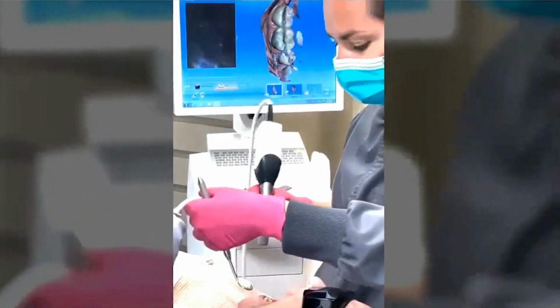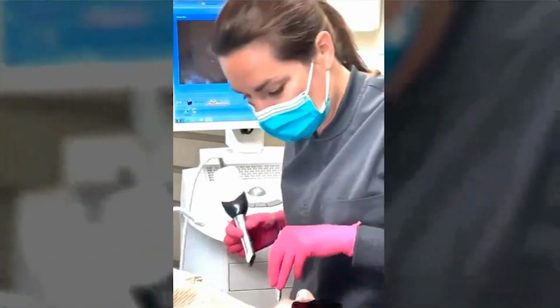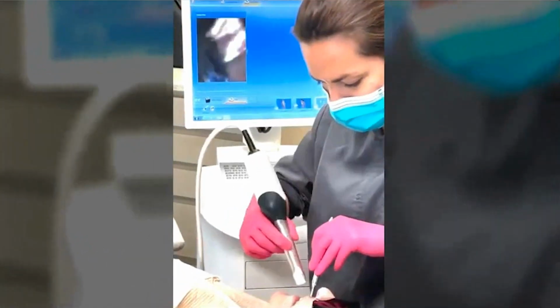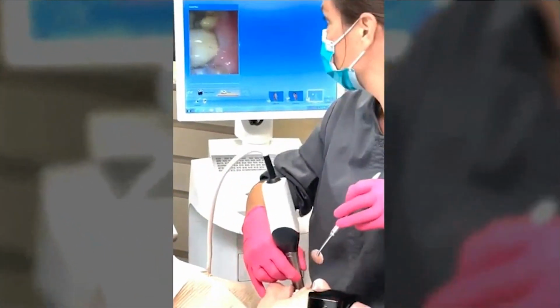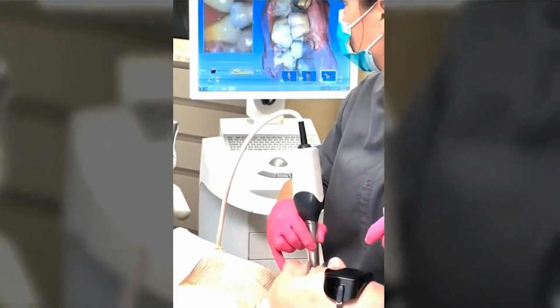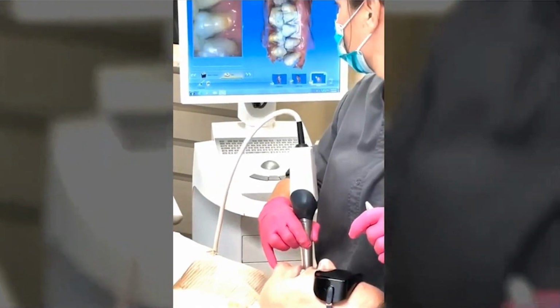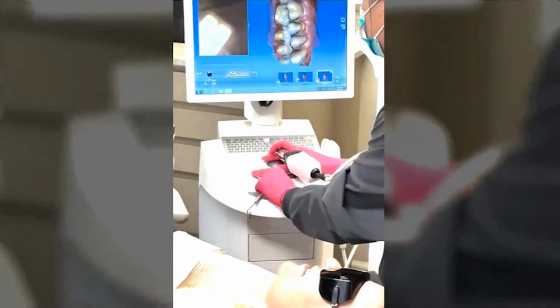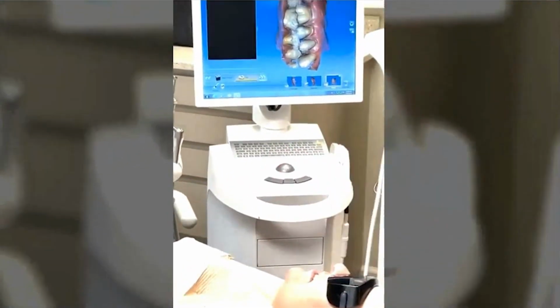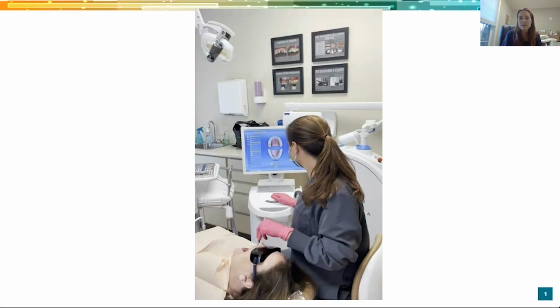You always want to make sure everything is nice and dry too. You don't want to scan any air bubbles, saliva, or any blood on your prep, because then you're not getting a really great scan, and it may not have as good of a fit. So it's very easy to be able to do that there. I had just done the bite, so that the machine will take into consideration the bite and occlusion and all sorts of forces.